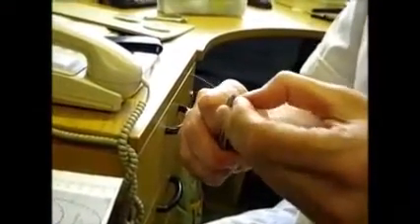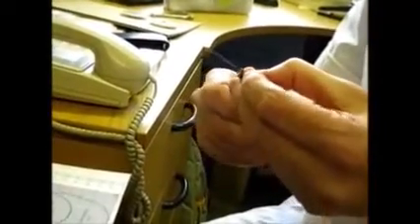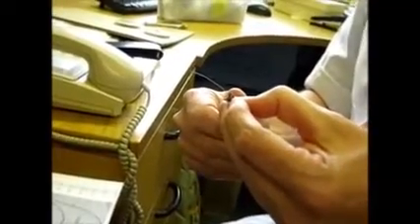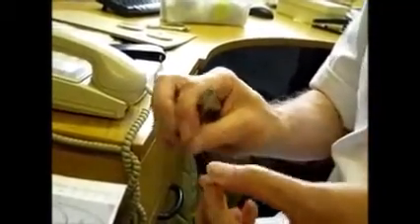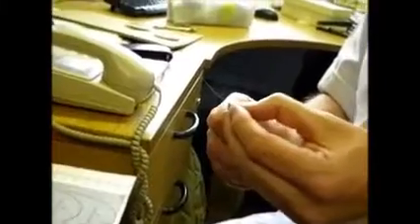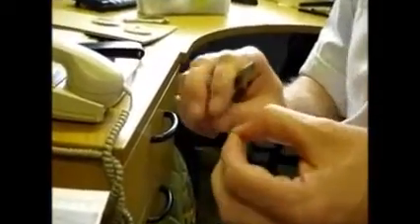Twiddle it over, as you say. You just keep bending it over, and I've made that a bit too. But yeah, they're not easy, and they were very difficult to do in a rectangular wire, and to keep them level. But something like that. But we don't do that. It's not normally done in this wire test, so you don't need to do that one.